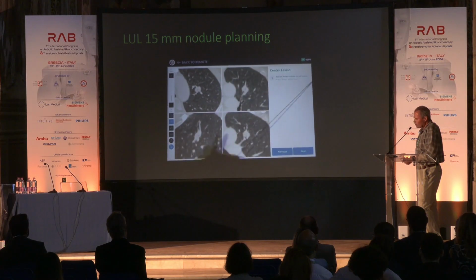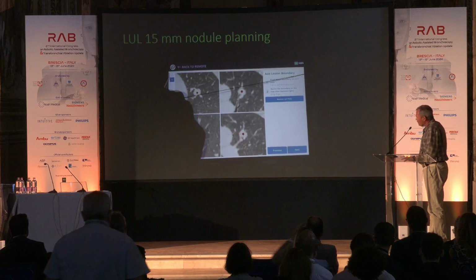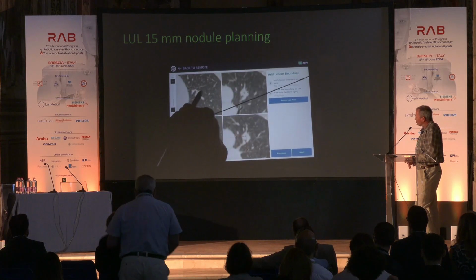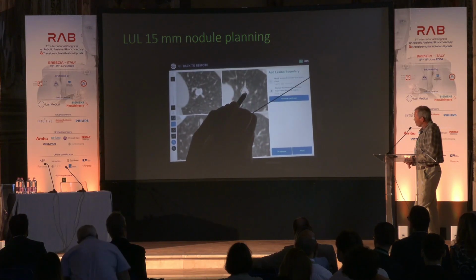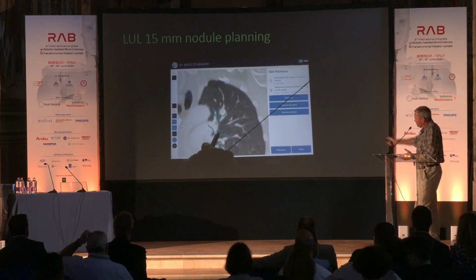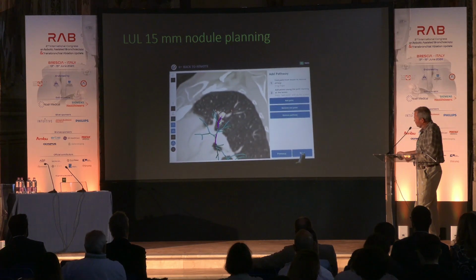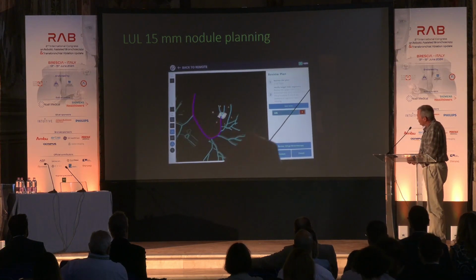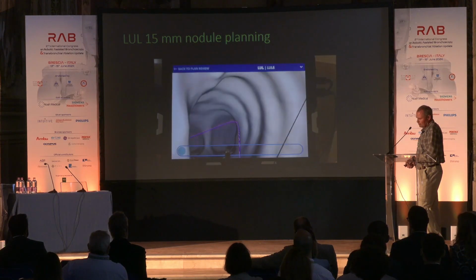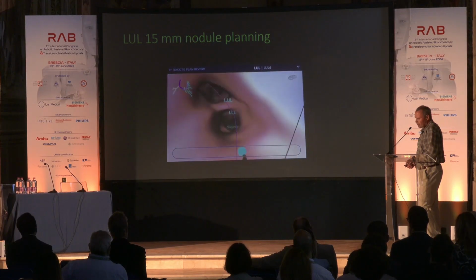We center it. Everyone who is using cone beam CT can see that this is the same process that you go through when you do a cone beam CT, which is called segmentation. Then you mark the borders of the nodule. This is not during the procedure, okay? This is before, and it is real time. So now you get this nodule, you mark the airway, and then you also get your pathway. There is even a virtual navigation to there.